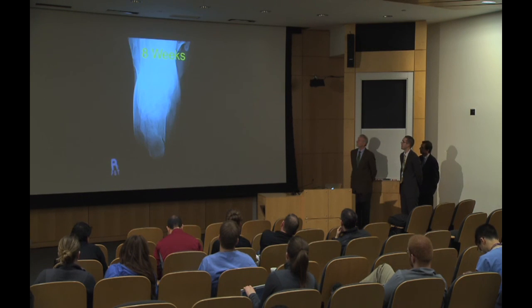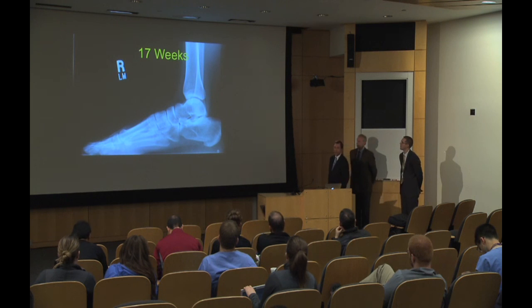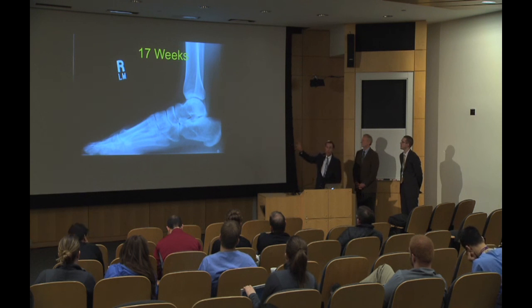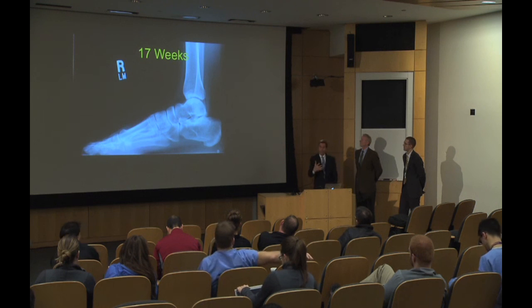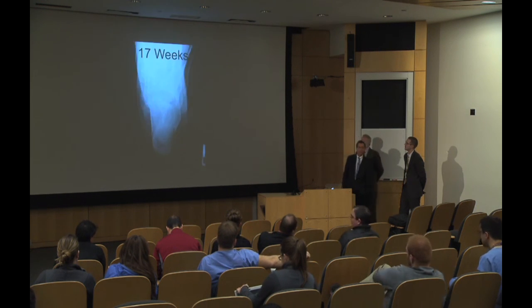and finally 8-week shots. So you can see basically she was compliant, because if you look at the height, it really is not appreciably different from the original injury, and most patients, if they're treated conservatively, have a hard time doing that because they end up inadvertently putting their foot down, and there essentially is insidious compression of the talus on the posterior facet, and that leads to more significant depression if you look at them later. But if they're able to be compliant, then potentially this would heal relatively quickly.